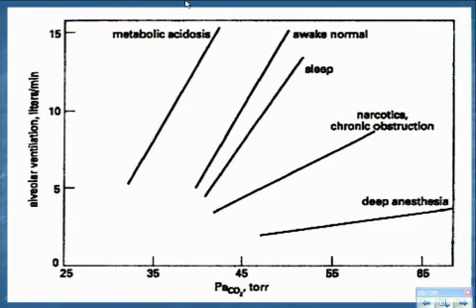On the other hand, when we give the person more anesthesia and get their pain controlled, you'll see that their respiratory rate will slow down and their CO2 will rise. Okay? And that's what you'd expect. We can actually use that value to titrate the narcotics at the end of the case. Two very, very different ways of thinking. Some people will very strongly argue that you should never use narcotics at the end of the case, because you can overdose a patient and they'll be apneic and you won't be able to get them to breathe.